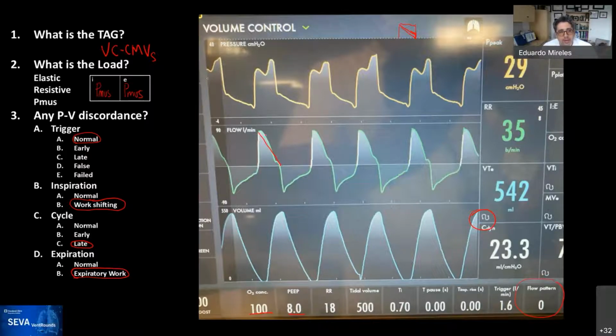So that's why I call this back to the basics, because in volume control you have to control the waveform completely. But when you are on this ventilator, it uses this thing, and the algorithm changes the waveform to look like that. Rob, any comments on that? Yeah, I wish I understood what the algorithm was doing, because it doesn't make any sense to me. Yeah, and we didn't know.